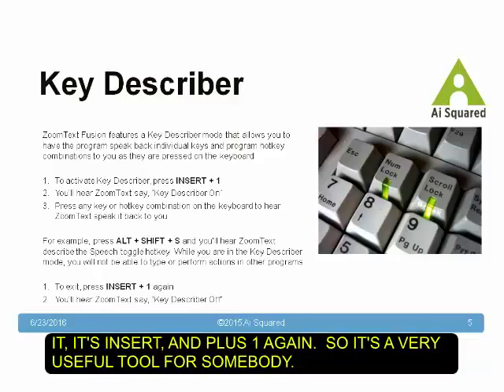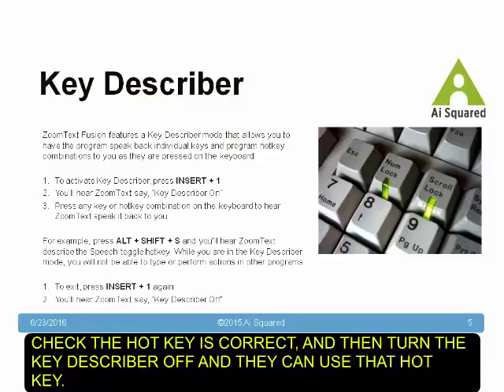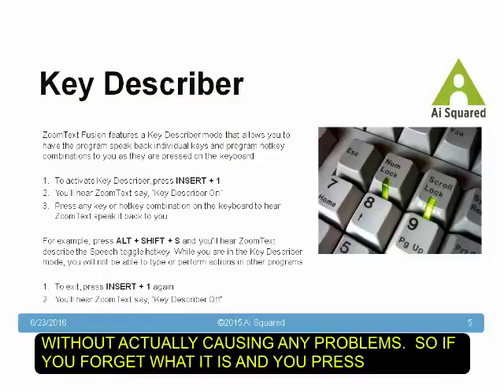So it's a very useful tool for somebody. If somebody forgets a hotkey or certain combinations of keys, they can just turn the key describer mode on, check the hotkey is correct, then turn the key describer mode off, and then they can use that hotkey without actually causing any problems.